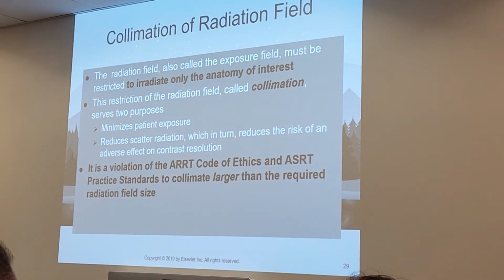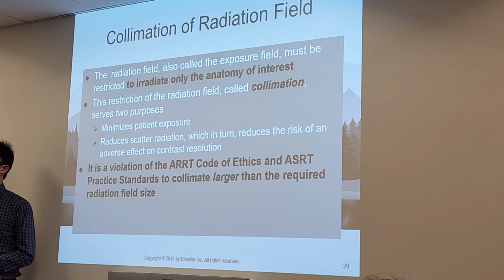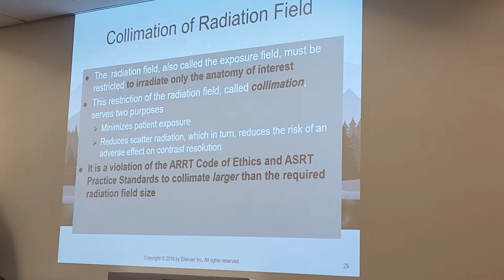Once again, I will warn you, when you go to clinic in the fall, you will see some techs that do not collimate, that say, open it up. I don't want to miss anything, open it up. But that is bad practice. If you have proper positioning, if you are able to put your anatomy in the correct location, you should not need to worry about missing anything. So make sure that as students you practice proper collimation.